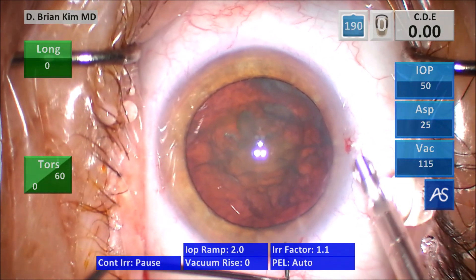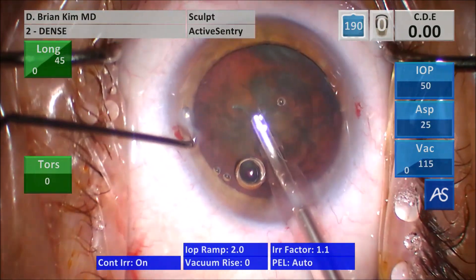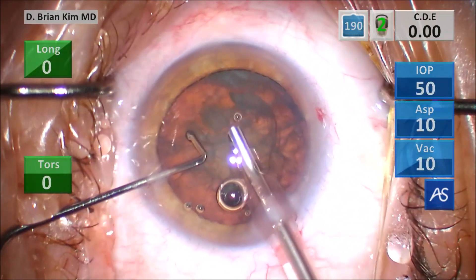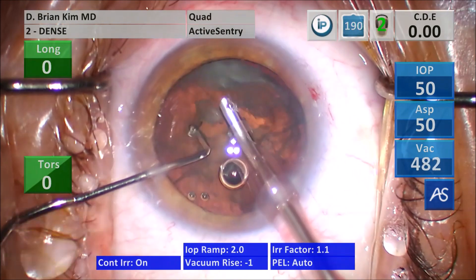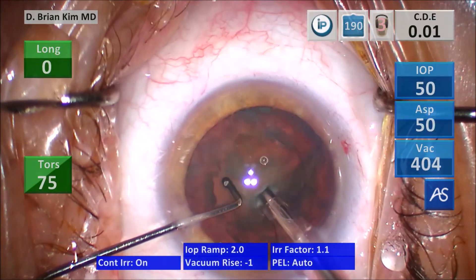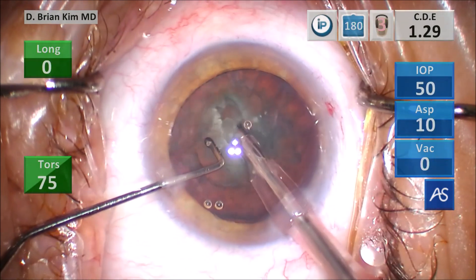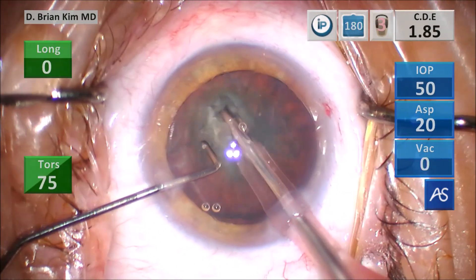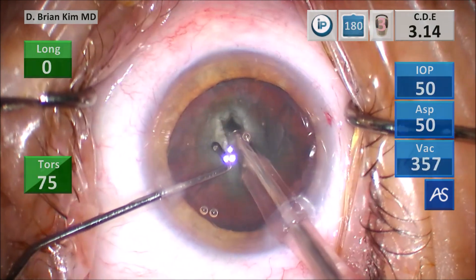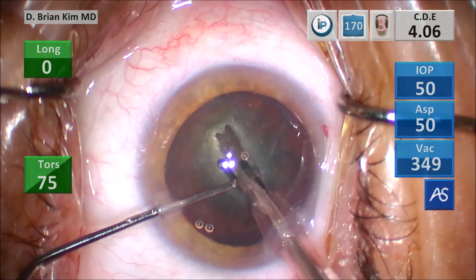I lift the incision, go in with irrigation off, activate irrigation, and I'm in the dense cataract setting mode. I switch to quad mode to remove the surface lens material, then turn bevel up. I forgot to switch back to sculpt, so I was in quad mode the entire time — only in retrospect did I realize that. Not as efficient for sculpting power, and there's unnecessary vacuum during this step, but I don't think it was detrimental.